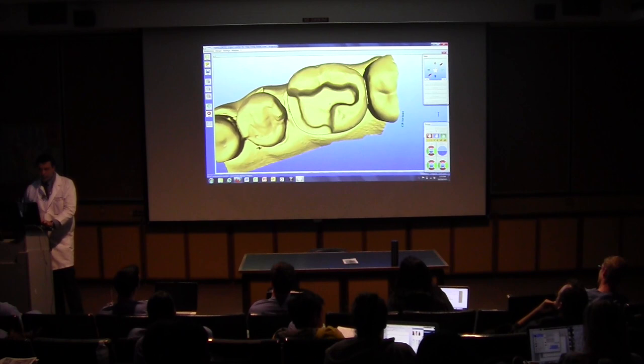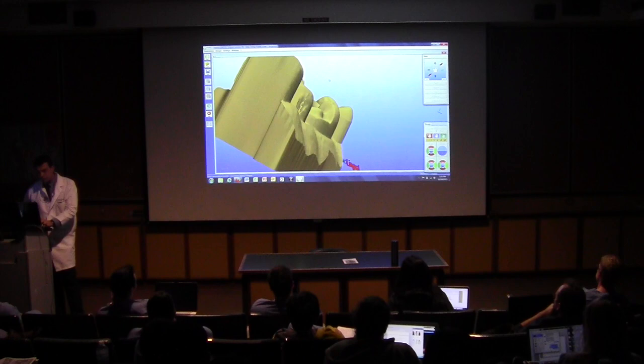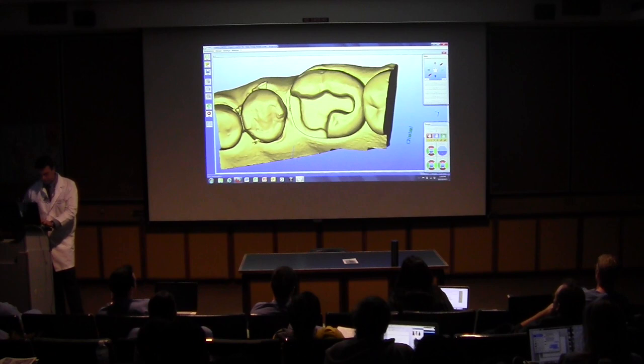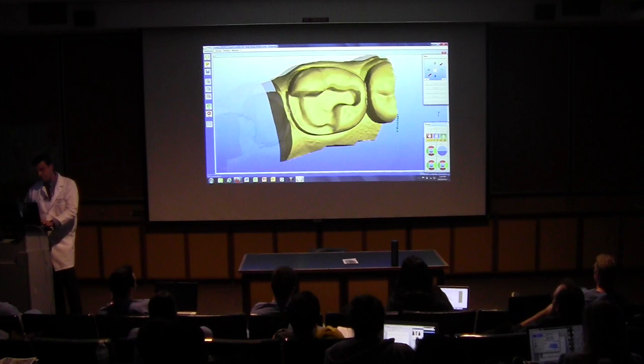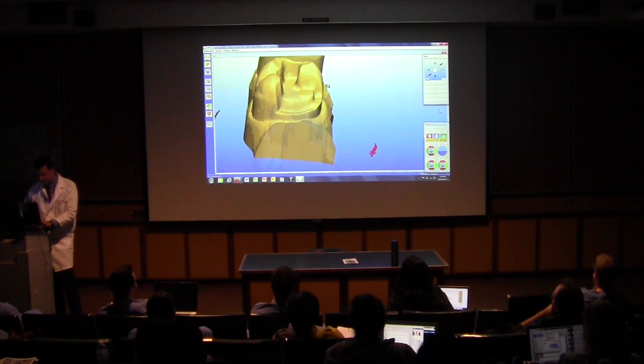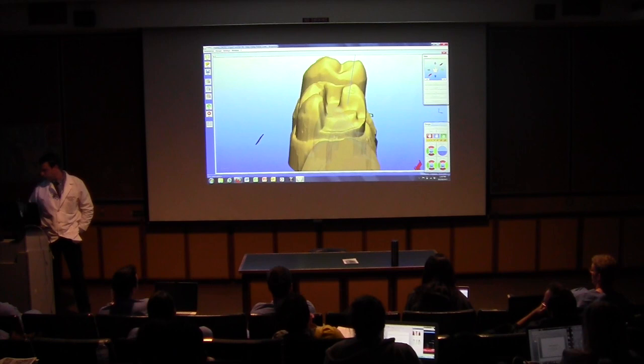Let's follow the rules that you just learned from Dr. Porto's lecture. First of all, do we have enough divergence here on the walls? I just cut this tooth in half here, I'm sorry. One second. Oops, I don't have a mouse here. I'm fighting. Just track that. Okay, do we have divergence there? Yeah. Do you think it's closer to 6-8 degrees? Yeah, it's pretty close, right?